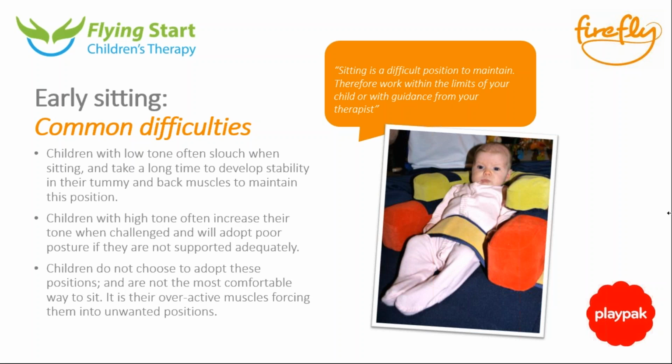So other difficulties would be that children with low tone slouch forward and almost form too much of a C shape with their back, and they don't generate the strength to sit themselves up, so they would obviously need a lot more support. And children with high tone who throw themselves backwards, when they're challenged, if you put them in sitting and they're challenged, they'll then throw themselves backwards and almost banana in a backwards shape, which would then lift their pelvis off the floor. So again, they would need enough support so that their body didn't send them off into this tonal pattern.